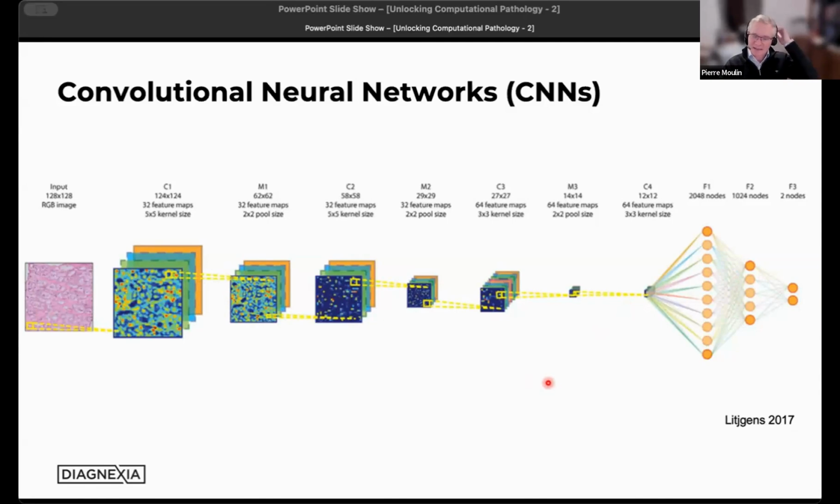So these are very powerful methods for tasks that are performed at a given magnification or at a given MPP, for instance for nucleus segmentation, or identification of tumor-infiltrating lymphocytes, or in a derivative of classification, which is segmentation, separating the PDL1 labeling from the background, for instance.